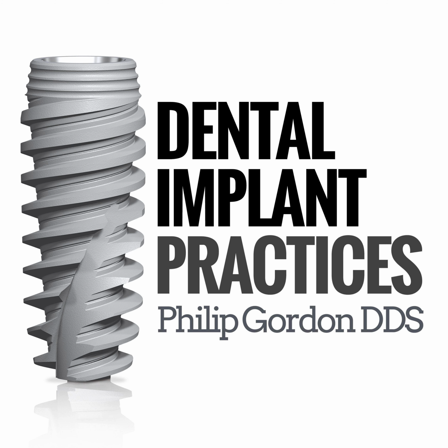Exactly. What kind of final restorations can you do? I know they're in a PMMA with the metal bar in there for strength, and I think that's fantastic. But what kind of final restorations are we talking at the end? Let's say someone's got 4, 5, 6 implants. They can support any kind of prosthesis we want. We've got nice AP spread. Everything's an option. What are you guys doing for restoring?